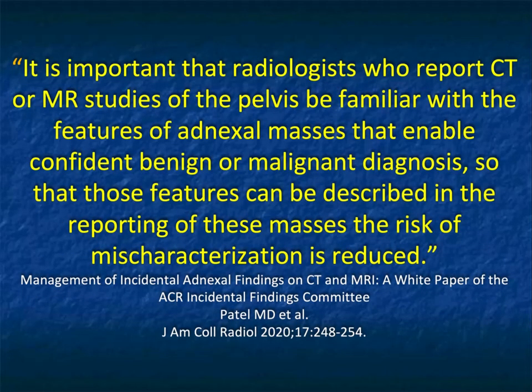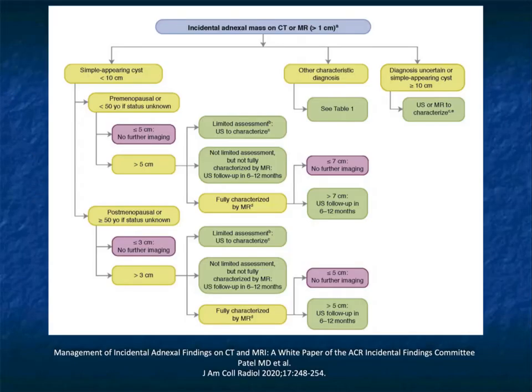It's important that radiologists who report CT or MR studies of the pelvis be familiar with the features of adnexal masses that enable confident benign or malignant diagnosis, so that those features can be described in the reporting of these masses and the risk of mischaracterization is reduced. So again, you want to be really good at making the right diagnosis.